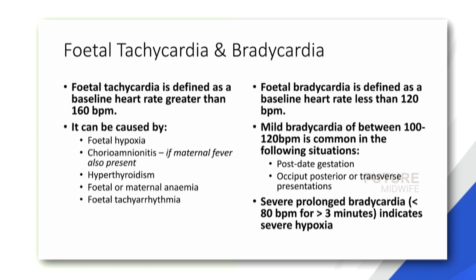Mild bradycardia of between 100 to 120 beats per minute is common in the following situations: post-date gestation, occipito-posterior or transverse presentation. Severe prolonged bradycardia, less than 80 beats per minute for more than 3 minutes, indicates severe hypoxia.